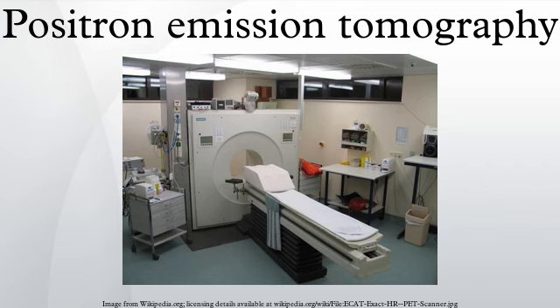common outside the brain. At the Jülich Institute of Neurosciences and Biophysics, the world's largest PET-MRI device began operation in April 2009, a 9.4 Tesla magnetic resonance tomograph combined with a positron emission tomograph. Presently, only the head and brain can be imaged at these higher magnetic field strengths.